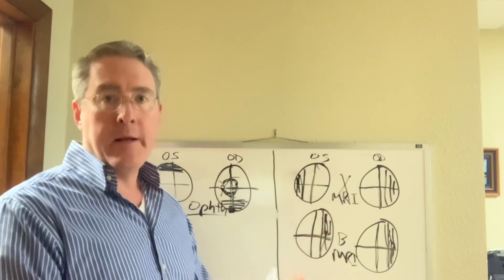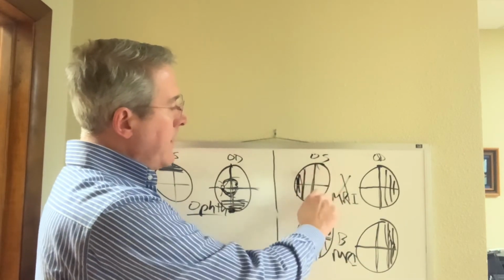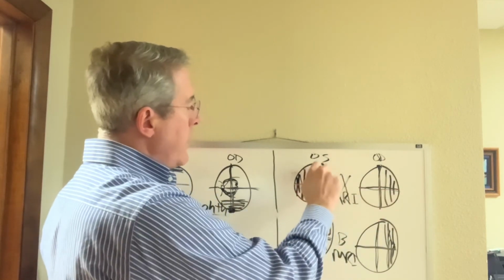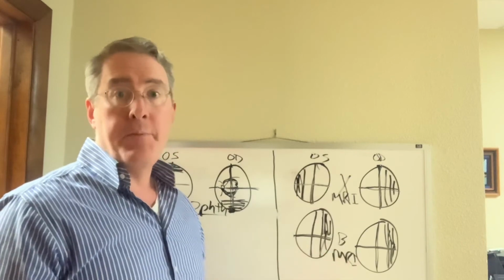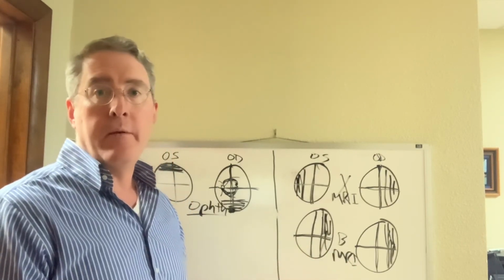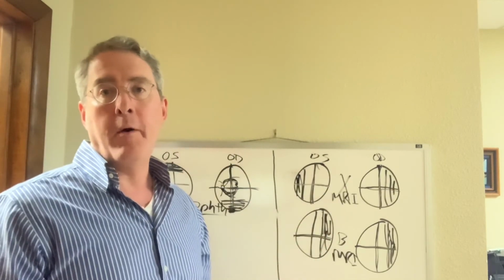He had a problem in his eye. For the people whose visual field defects respect the vertical midline but cross the horizontal, even if it's quadrantic, those people get an MRI. So really there's only two decision points to make with a visual field. Do they see an ophthalmologist or do they get an MRI?